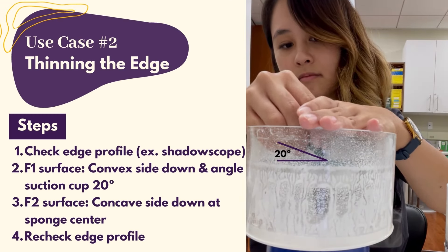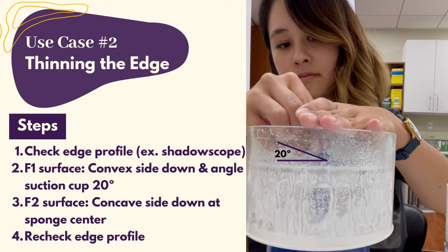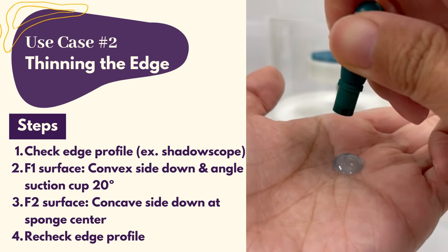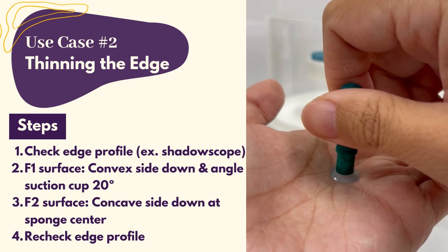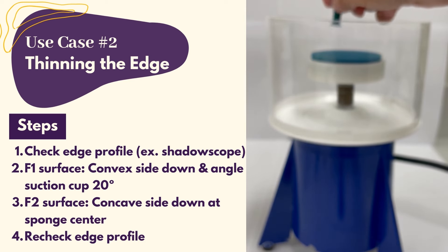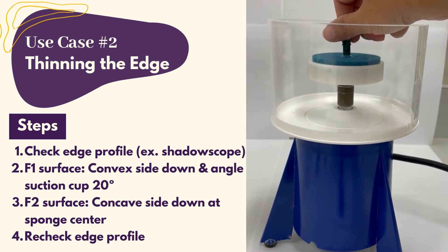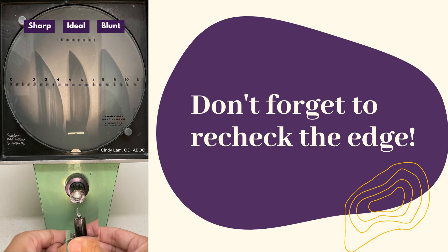To remove plastic from the front surface, place the lens convex side down and angle your greenie 20 degrees from horizontal. To remove plastic from the back surface, place the lens concave side down at the center of the flat sponge. Don't forget to recheck the edge as you go.